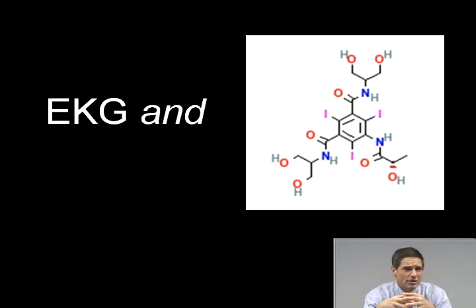This is a map of the coronary arterial tree, and it's obtained with EKG and IV contrast. For a 64 slice scanner, your heart rate's got to be below 70, and many patients will require beta blockers to get to that rate. CT scanners with more slices and faster imaging can obtain CT angiography of the coronary arteries at higher heart rates, and we'll visit this scan in the appropriate context.